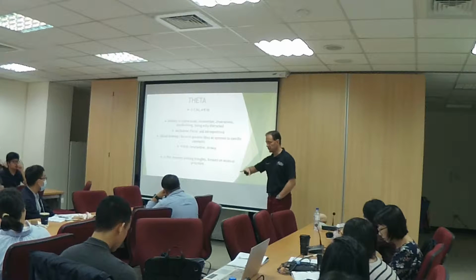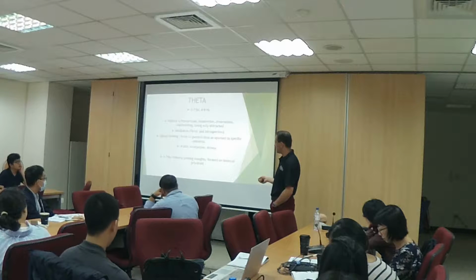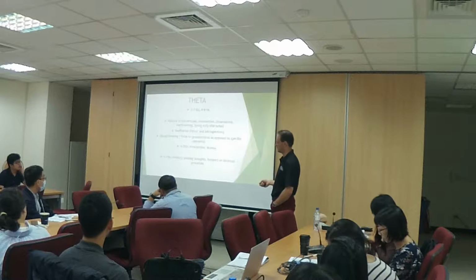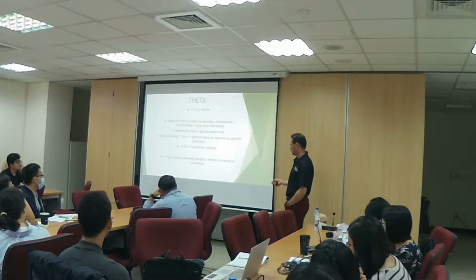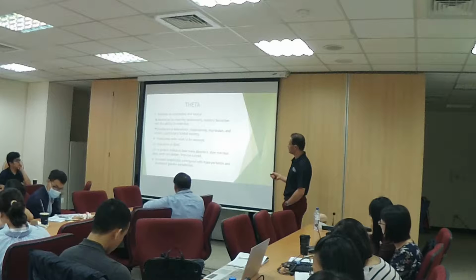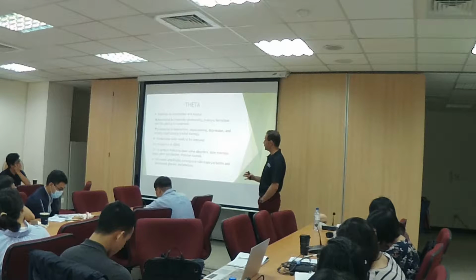Now, it's also seen in focus and introspection during meditation. So there's a certain theta pattern that can be enhanced with meditation, which is good. It's more for global thinking, and it's got two sides to the story. So the 4 to 5 is the slower side, and the 6 to 7 is probably the better side of things. Now, it depends on what you're looking at in the EEG. So again, these are some generalities. It's not the whole picture. It depends on where it's localized and what sources, where in the brain we're seeing it.